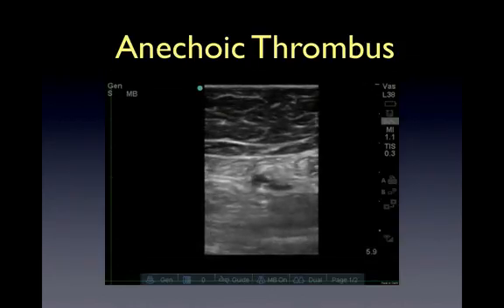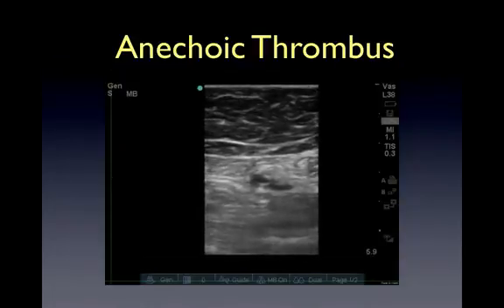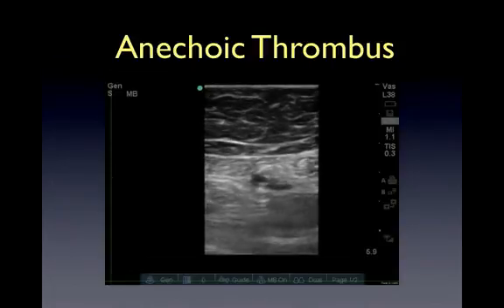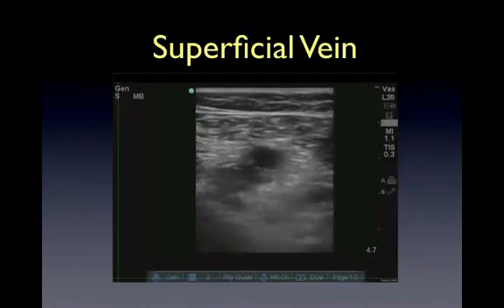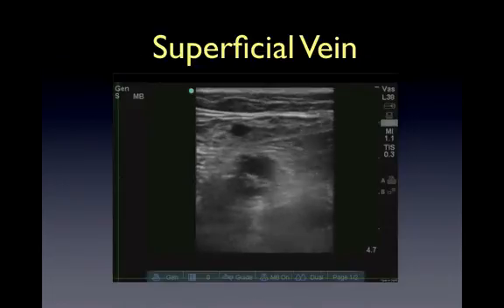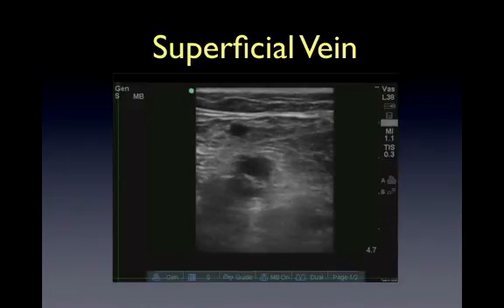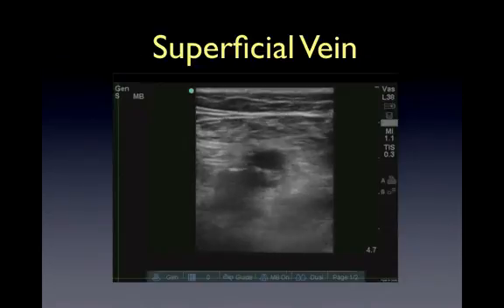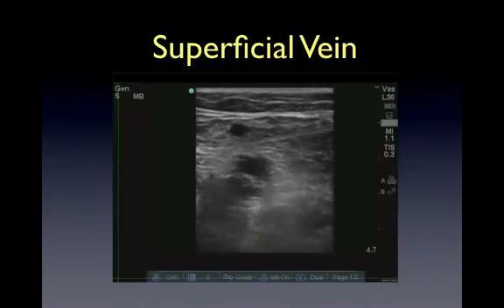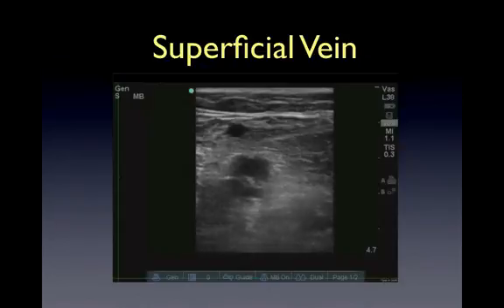This image shows an anechoic thrombus where the anterior and posterior walls of the vein are not completely touching — this would be a positive study for a DVT. Here we see a superficial vein in the upper left portion of the image which is completely collapsing, and the popliteal vein in the middle of the screen which is not collapsing. You may mistakenly think there is no DVT if you think the superficial vein is actually the deep vein, calling this negative when it is actually a positive study.